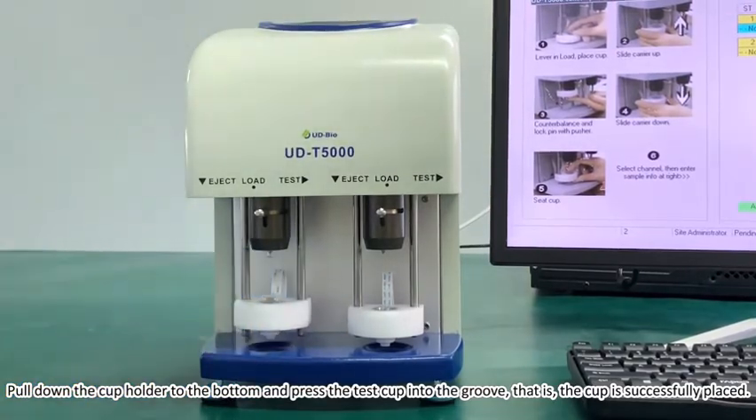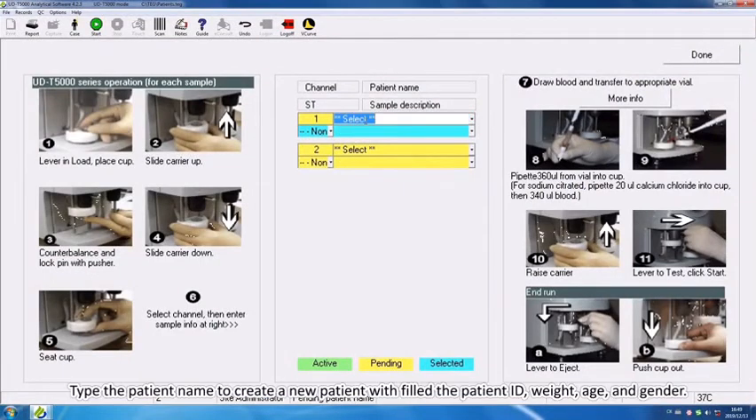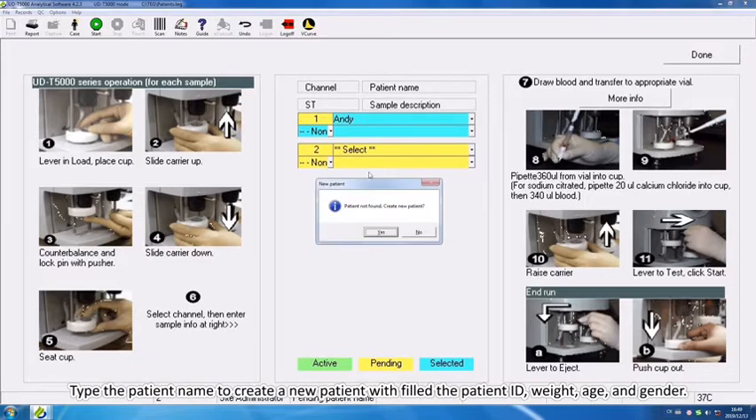The cup is successfully placed. Type the patient name to create a new patient. Enter the patient ID, weight, age, and gender.